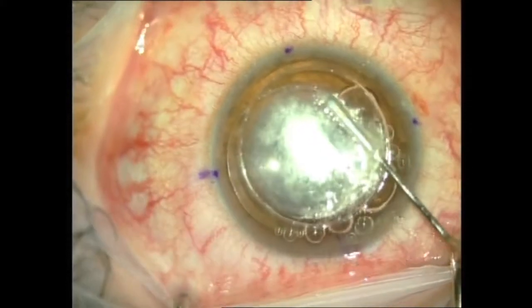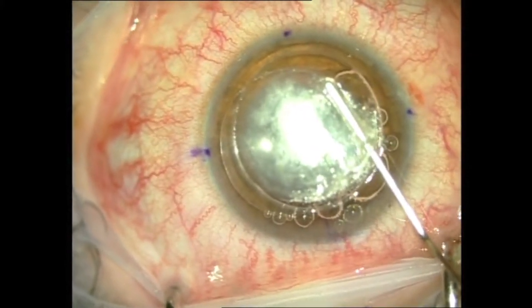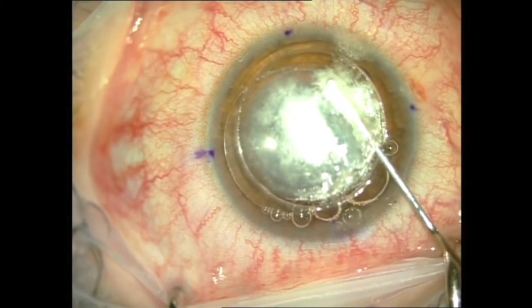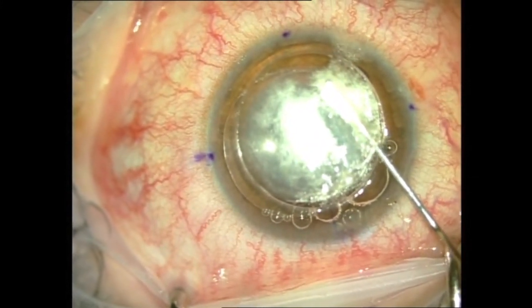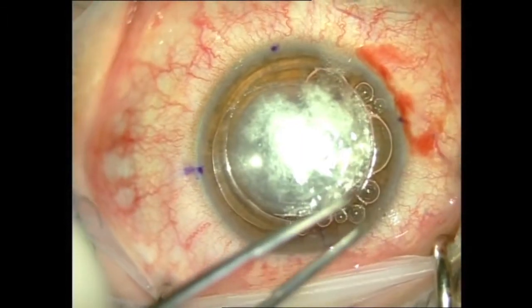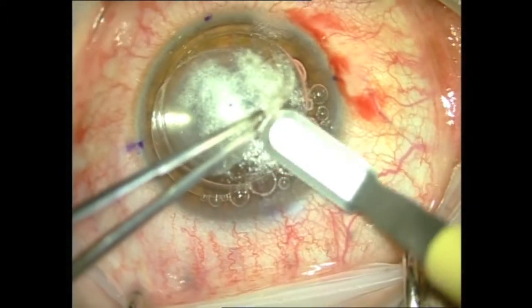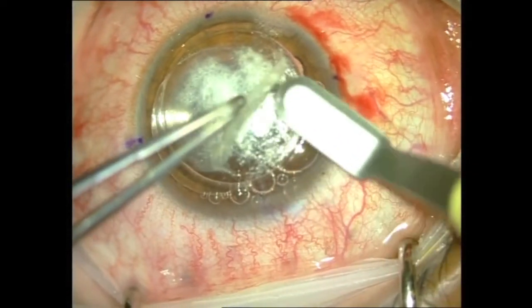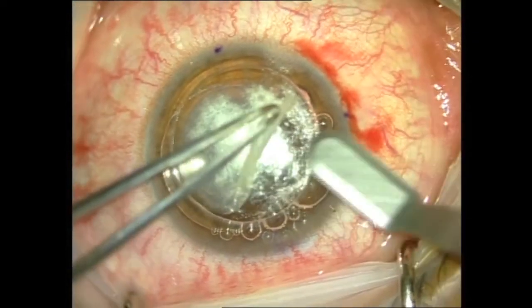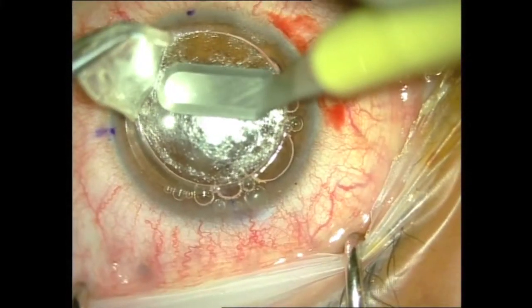Since I have a formed type 2 bubble, I usually perform a manual dissection technique, and to complete this I need more stromal whitening. So I am now injecting air in all the quadrants of the cornea to produce stromal whitening. Then the usual superficial keratectomy, removing the superficial layers of the stroma.